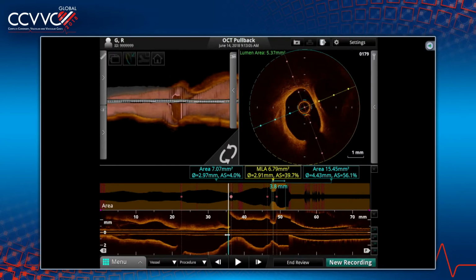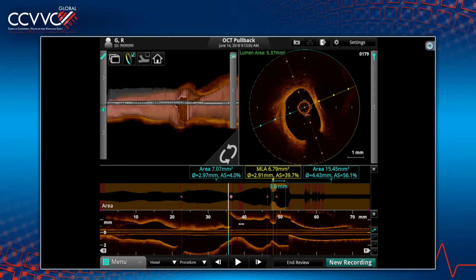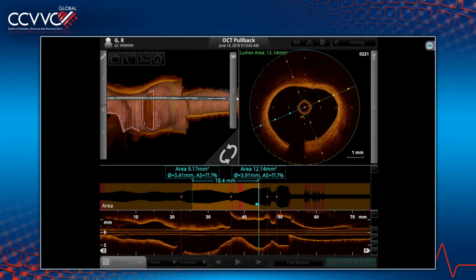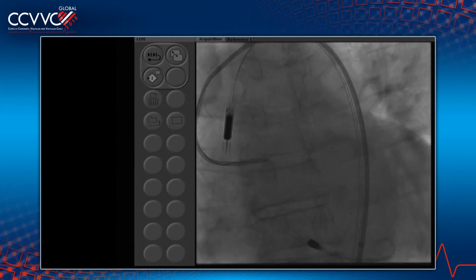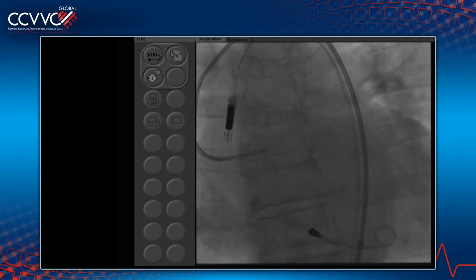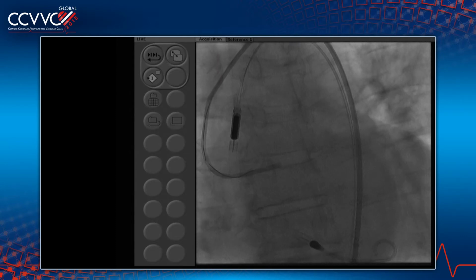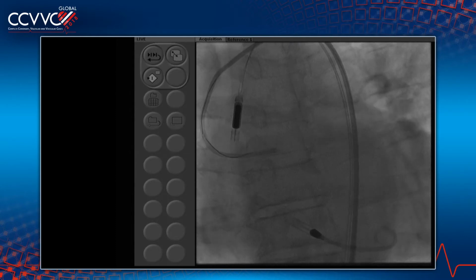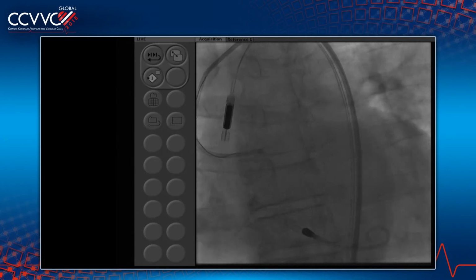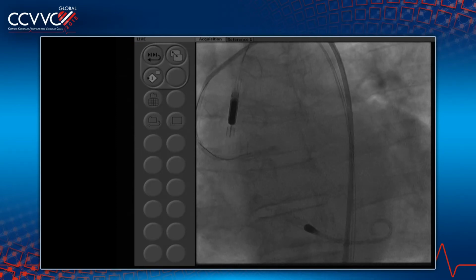Who would do this radially? It looks like, for sure, 3 or 4 people, 5 people here would do this radially. Dr. Kini, what are you doing? I mean, Nitin Barman is there, he's saying, why aren't we doing this radially? Okay, I don't know, ask the panel how many people would do radial. Many said half and half. You should have told me beforehand. I would not have pulled it off. Okay.